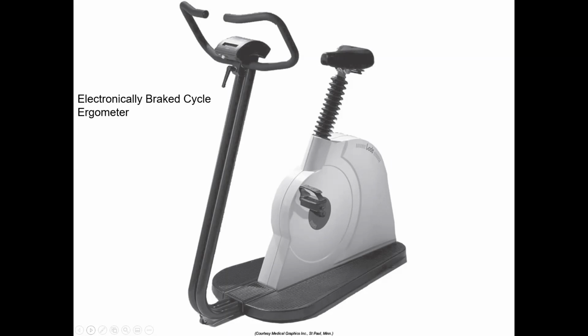This presentation is not all about protocols, but just understand that it really has to do with increasing things like the resistance that's on an ergometer, or the incline and/or speed of a treadmill.